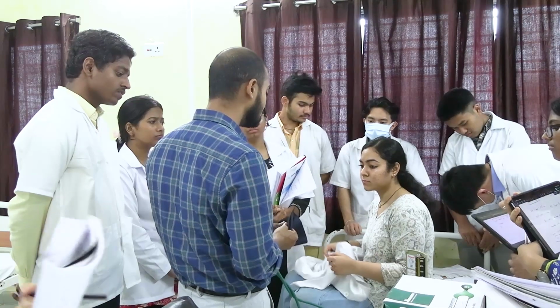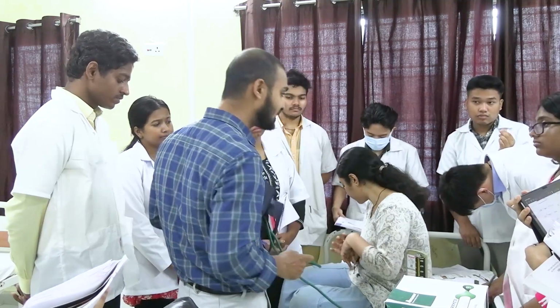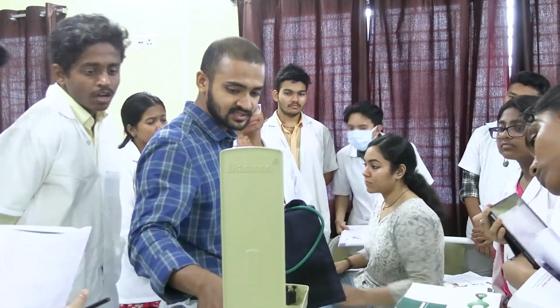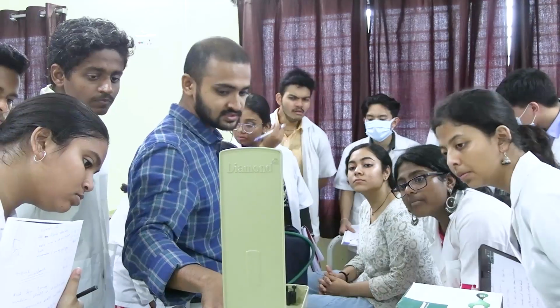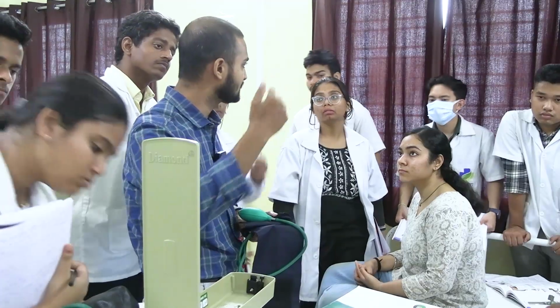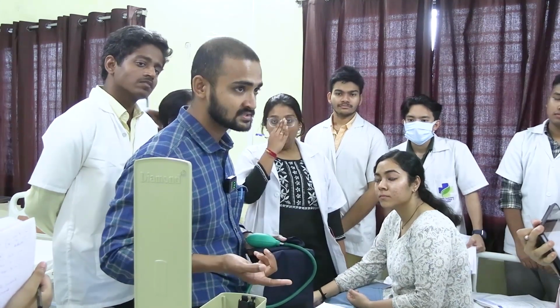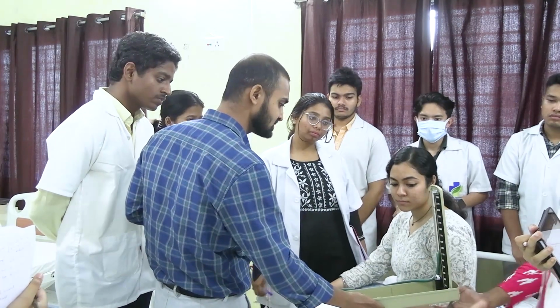So before starting, inflating the cuff, with this valve, you have to ensure that the mercury reading is at 0. Okay, you can see the 0. See whether it is at 0 or not. It shouldn't be above the 0 mmHg or below the 0 mmHg. It should be exactly at the 0 mmHg before starting, and you have to also see after it ends. This is to avoid errors. So can you again please hold it?